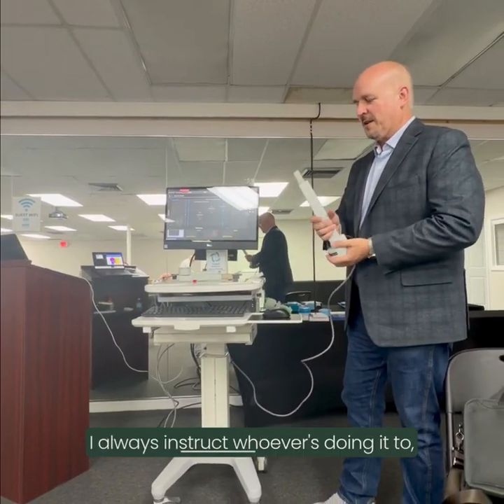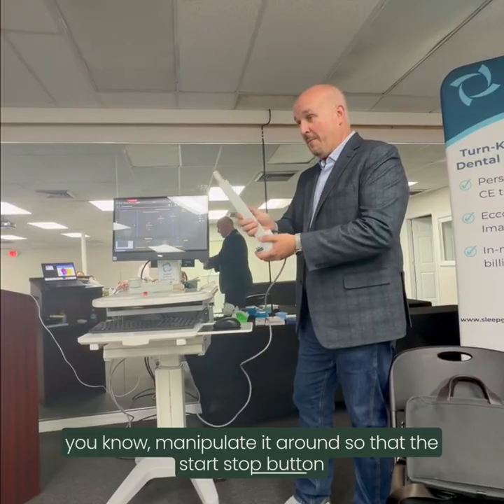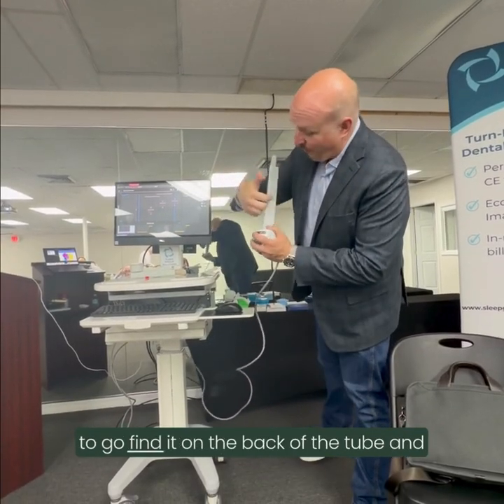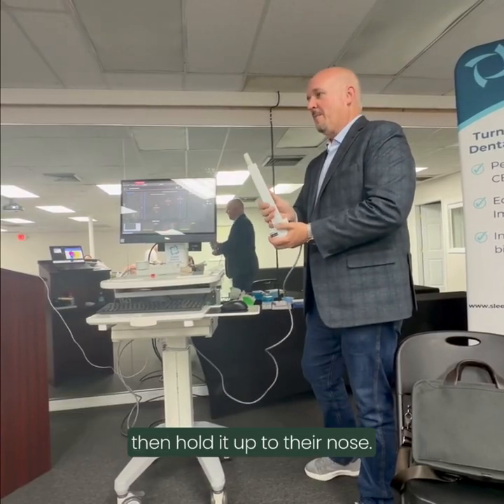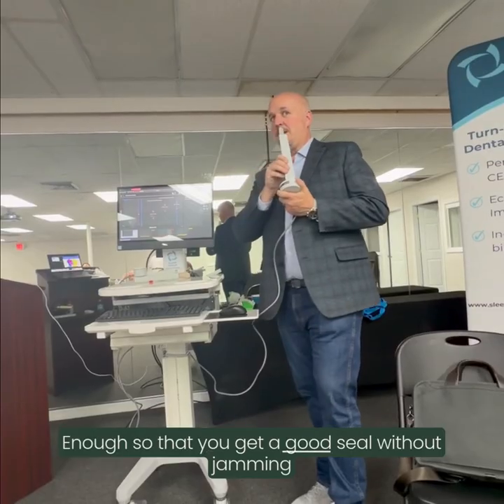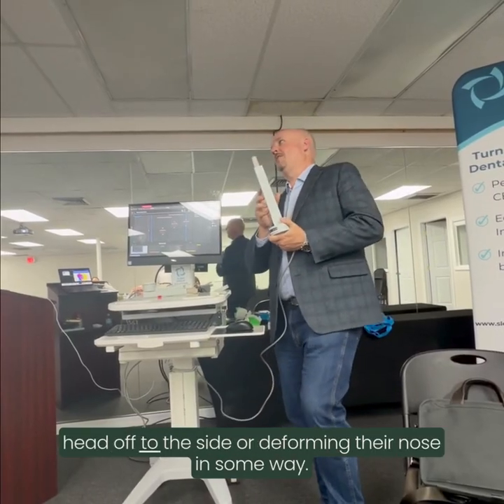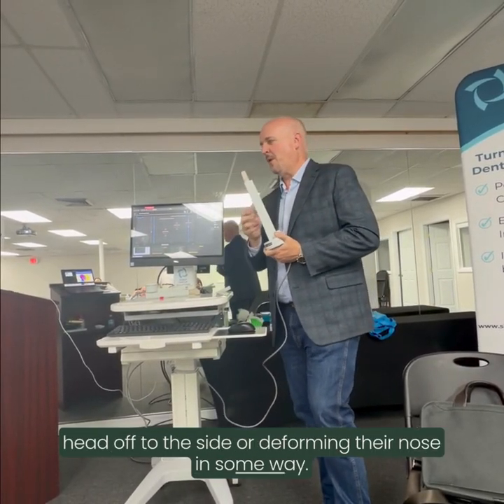You can twist this nose tip around however you need to. I always instruct whoever's doing it to manipulate it around so that the start-stop button is right in front of you, so you're not having to go find it on the back of the tube, and then hold it up to their nose enough so that you get a good seal without jamming it in their nose or pushing their head off to the side or deforming their nose in some way.